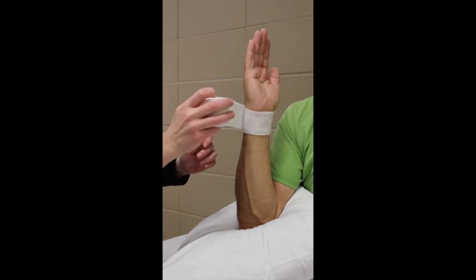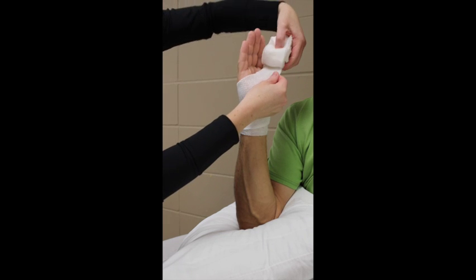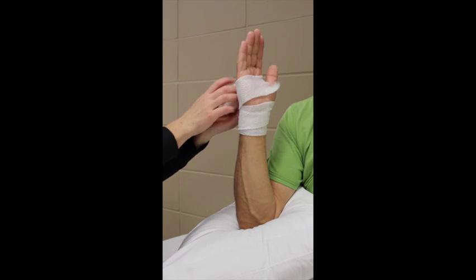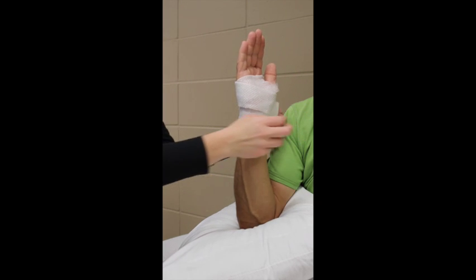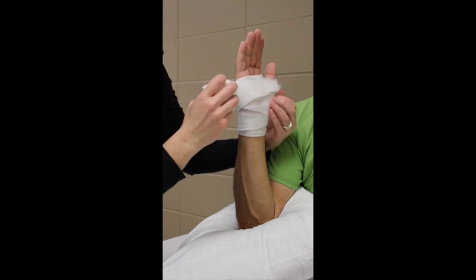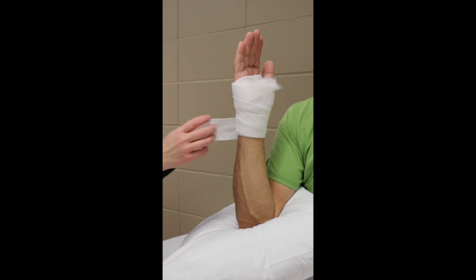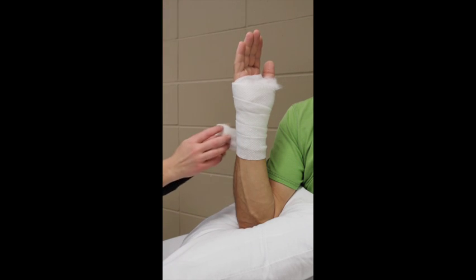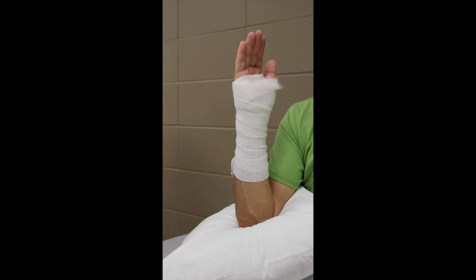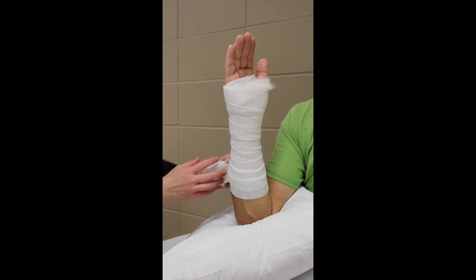Start with the padding around the wrist — this will keep you from fussing with the end of the padding. Then work your way toward the palm, tearing from the bottom to go through the first web space. Notice the padding ends about the distal palmar crease, which allows for the MCP joints to be free. Come back around the hand and through the first web space again so we have two layers of padding in the palm. Work your way proximal, overlapping by 50%. The forearm is a cone shape, so it is easier to wrap the padding on an angle than to go straight around.